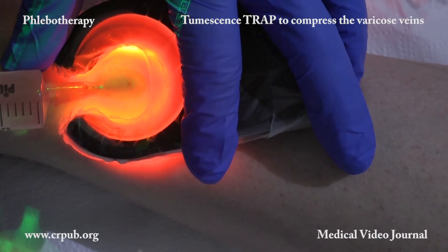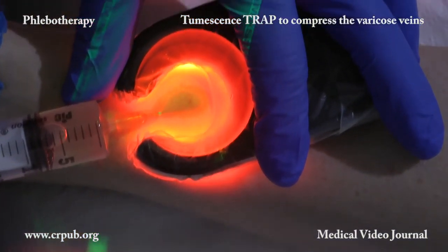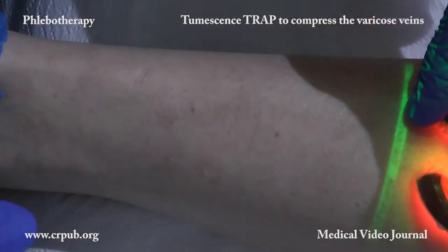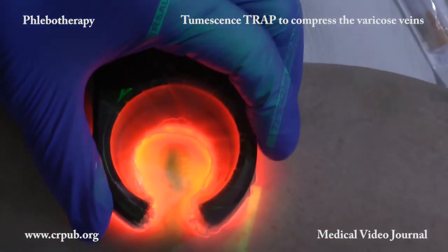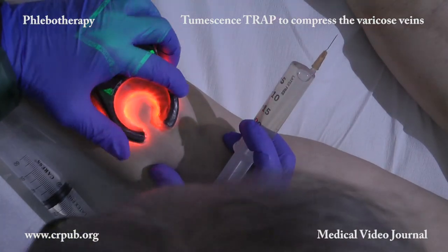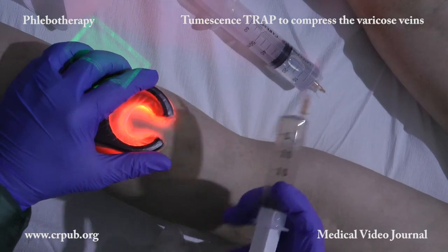This three-dimensional treatment restores the form and function of the veins of the superficial and non-visible venous circulation. Illumination with light close to infrared has revealed that numerous dilated veins are located in the popliteal cavity, an anatomical area that is difficult to compress. Compression is indispensable both during and after TRAP in order to counteract hemodynamic hypertension and to allow regeneration of the venous walls. In the first few hours after treatment, compression reduces intravenous collections of blood which may form after the regenerative solution has been injected into large calibre veins.